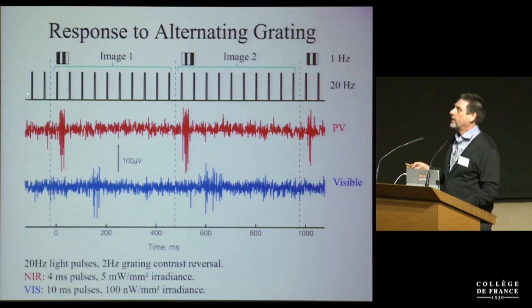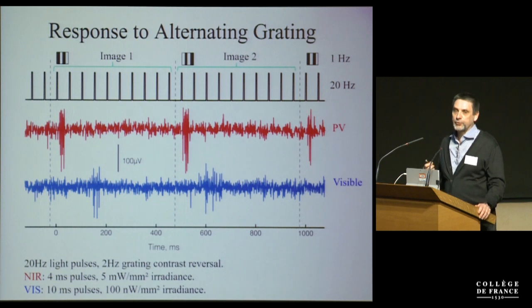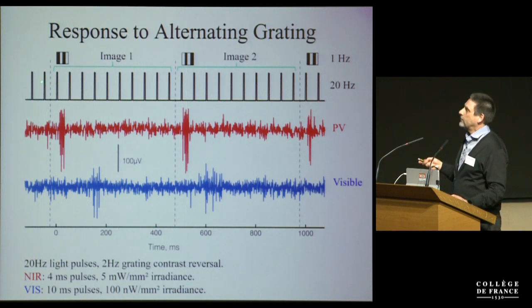So here what we see is that, like in normal vision, there is flicker fusion with prosthetic vision, so it doesn't respond to every pulse if it's at a high frequency. And there is adaptation to static images: if the image doesn't change, the retina doesn't respond. It responds only when the image is changing. And the same with prosthetic vision. So this is a benefit of going through the retinal network. We preserve these two very important features of vision: flicker fusion and adaptation to static images.